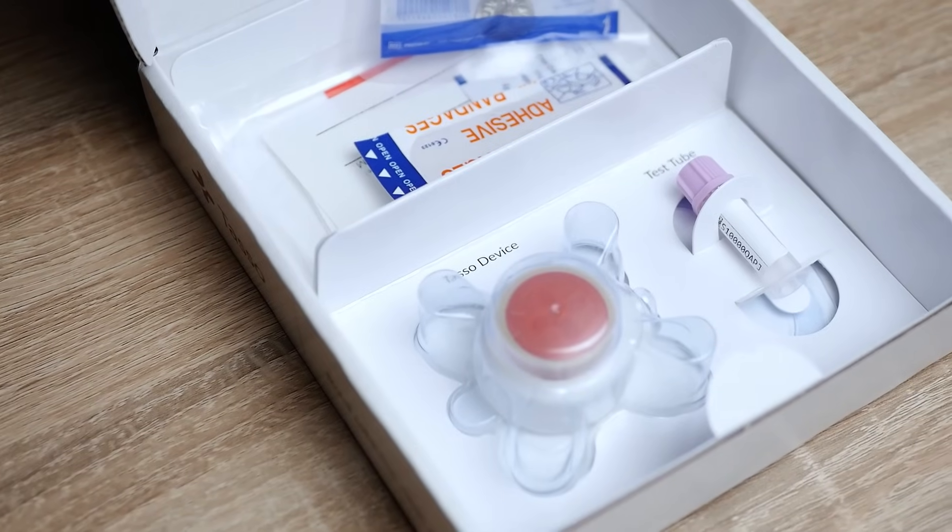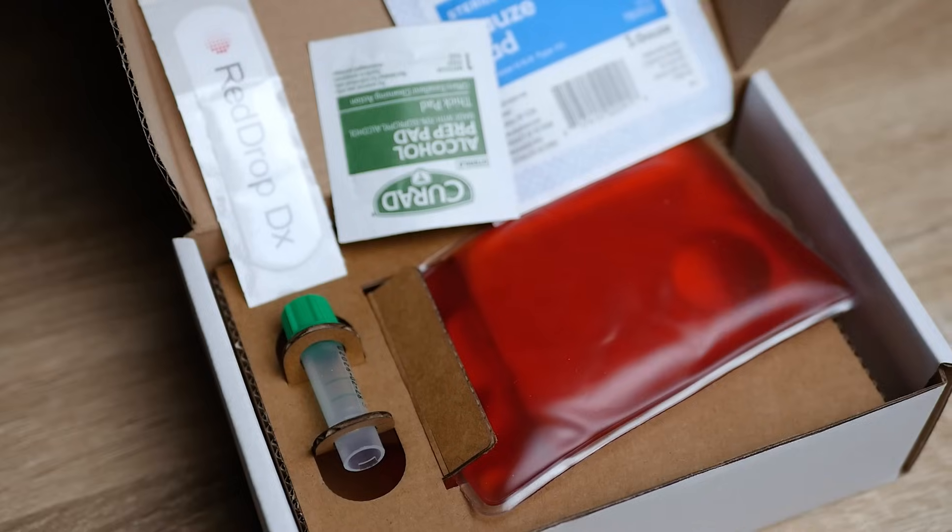Imagine a world where routine blood tests no longer require a trip to the clinic — no waiting rooms, no needles, no appointments. Just you at home taking control of your health. Today we are exploring the rise of at-home blood draw devices and we will test two leading innovations: Tasso and RedDrop.